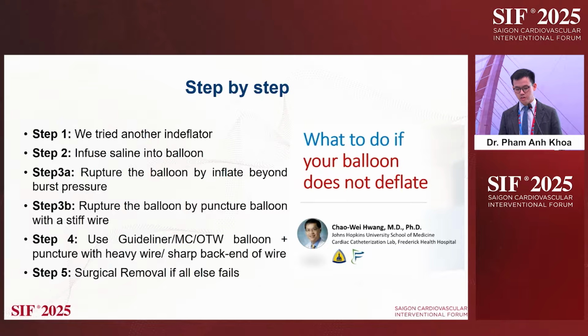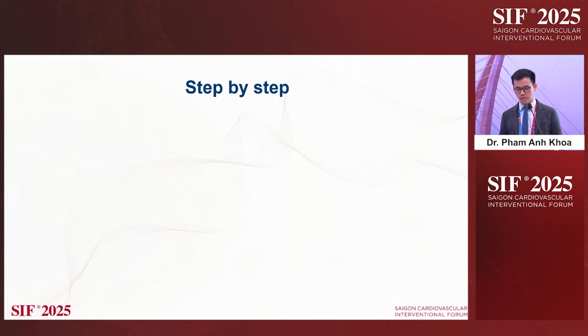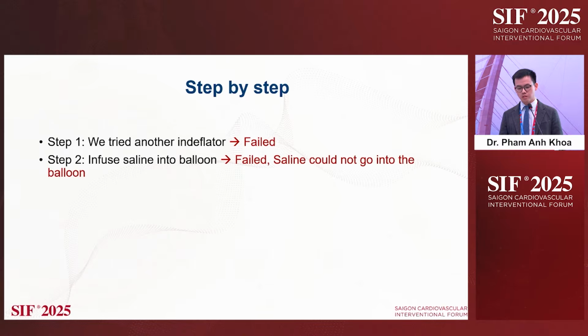Step 1, try to change the inflation device. Step 2, infuse saline into the balloon, and move on to step 3, step 4, and step 5. The first one, we changed to another inflator, but it didn't work. So this was not because of the inflator. Step 2, I still infused saline, but the saline could not go into the balloon, could not go into the central lumen of the shaft of the balloon. I tried many times, but it didn't work.